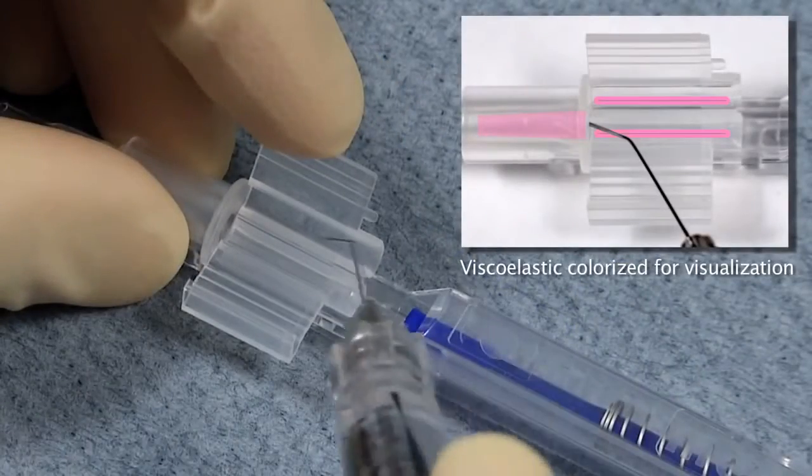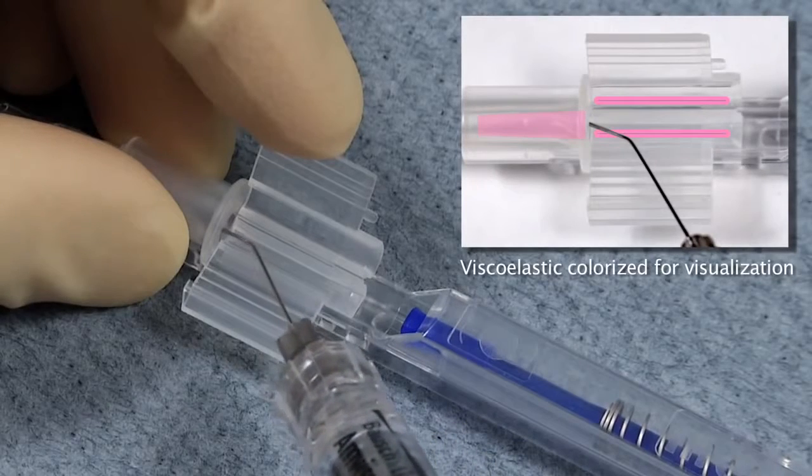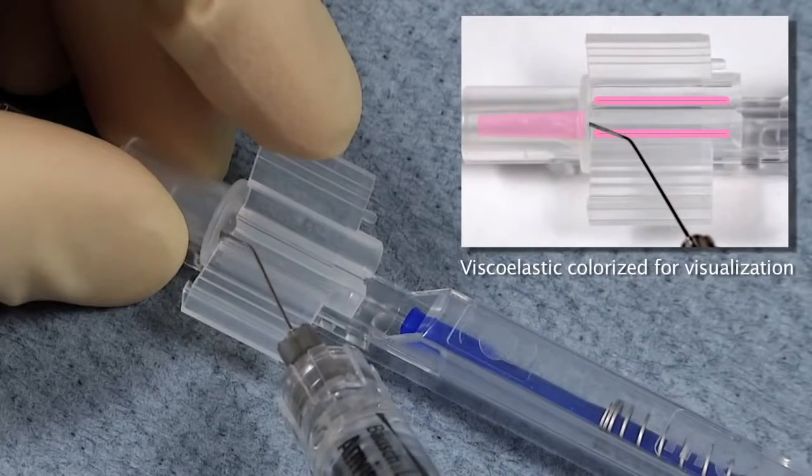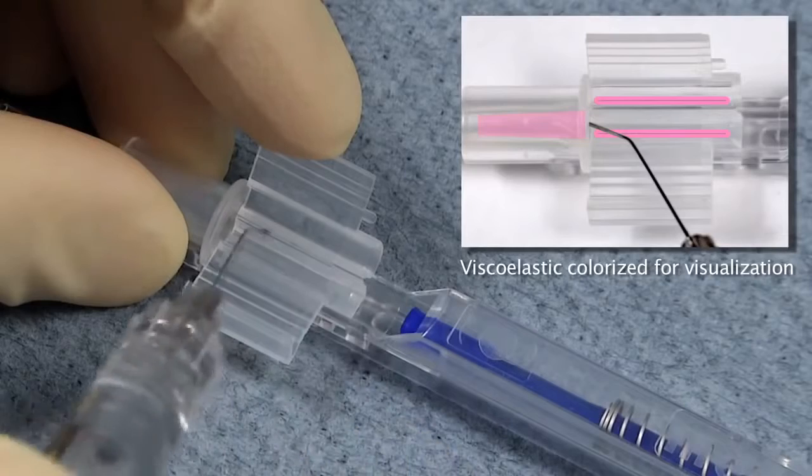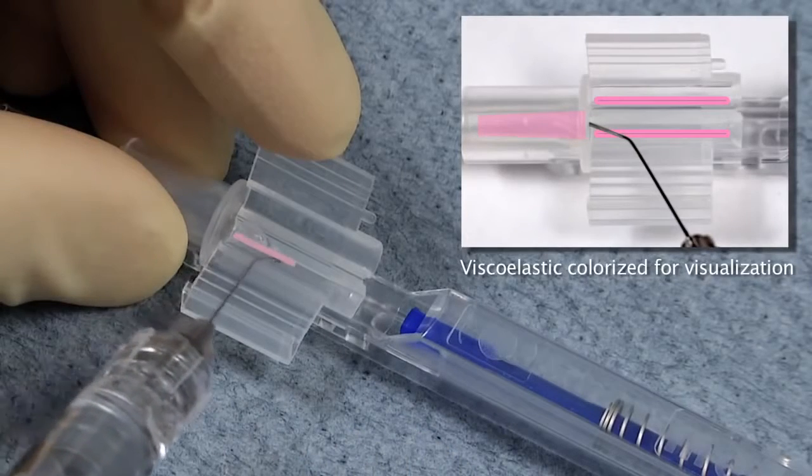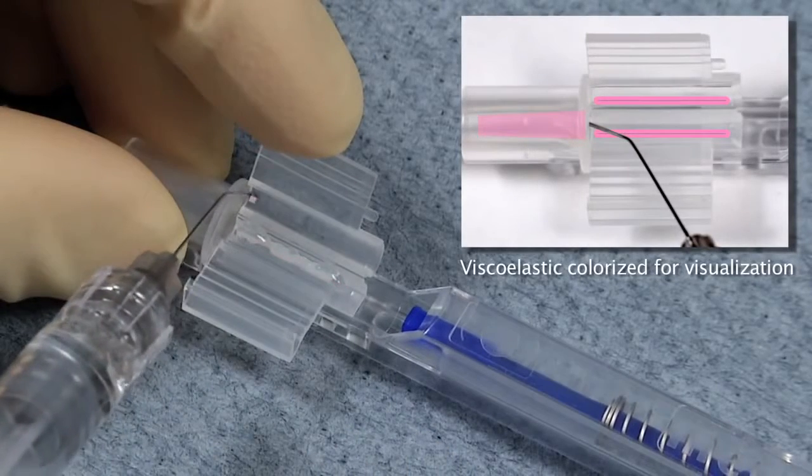Entering from the loading chamber side, apply AmVisc Plus or other Bausch & Lomb Viscoelastic directly into the conical tip and then apply two thin lines into the lateral grooves within the loading chamber.